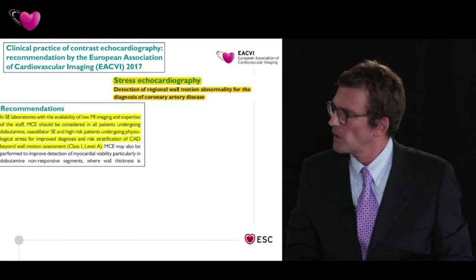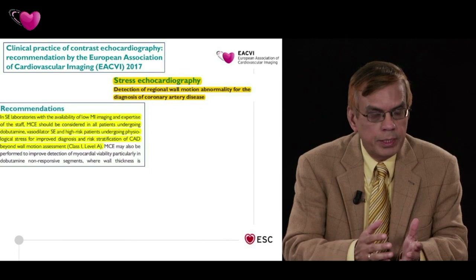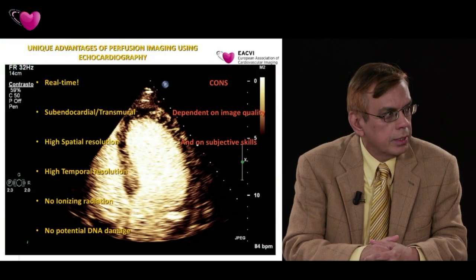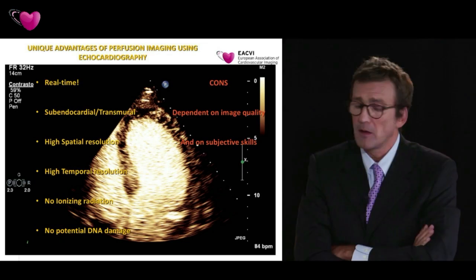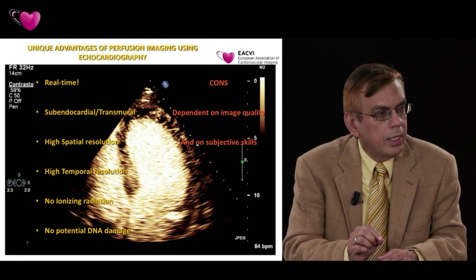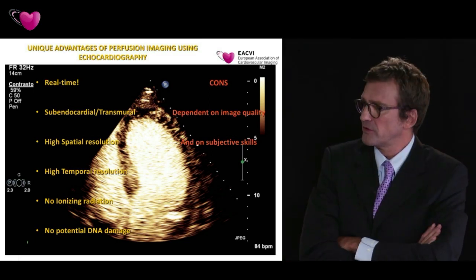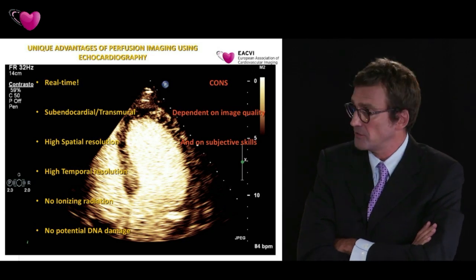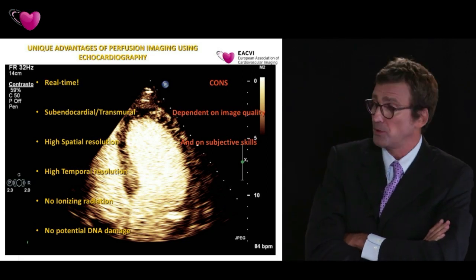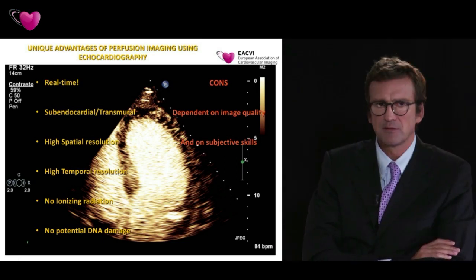Before you move on to the guidelines, Nicola, what you've shown there is you compared your imaging technique with the other imaging techniques like PET, SPECT, etc. Yes. But would you say that we have an agent which is a perfect flow tracer compared to any other agent available for any other technique? Yes, microbubbles are completely intravascular, and this is an advantage so that you can trace blood, actually. It's a percentage of the blood, so you can image blood, which is not possible with other pure technologies. So it's a blood tracer compared to any other imaging technique? Absolutely. This is a clear advantage.